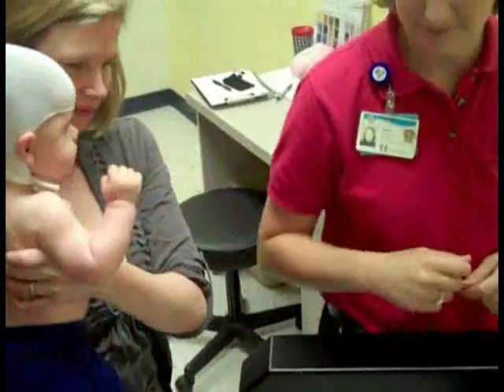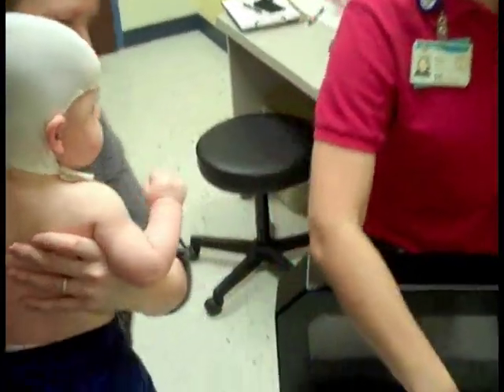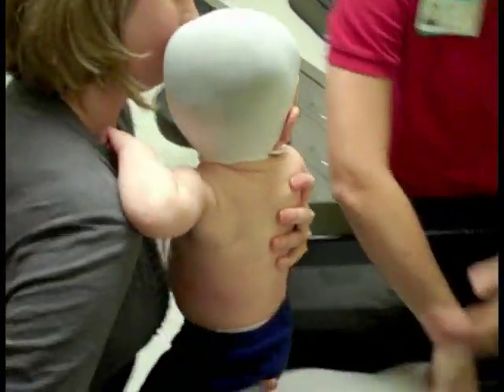Before we had the star scanner, the way we would do this is we would take a number of hand measurements of your child's head, which is often very challenging with a wiggly baby. And then we would do a plaster casting of the skull. The plaster casting would involve about a 15 to 20 minute process where we would lay strips of plaster over the child's head to get a good impression of your child's current head shape.